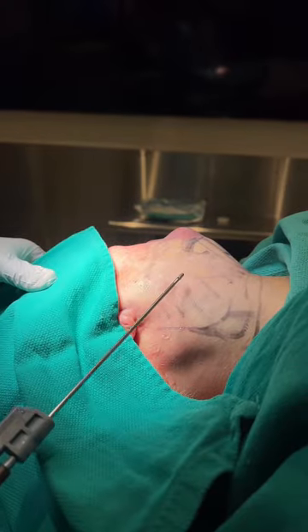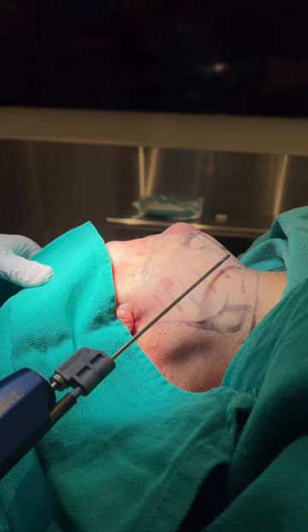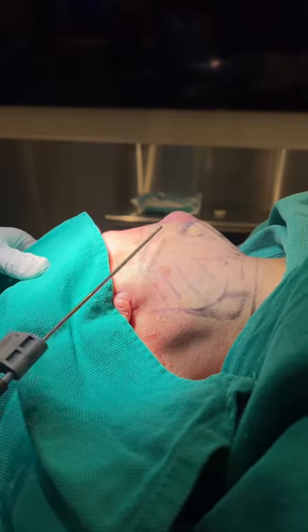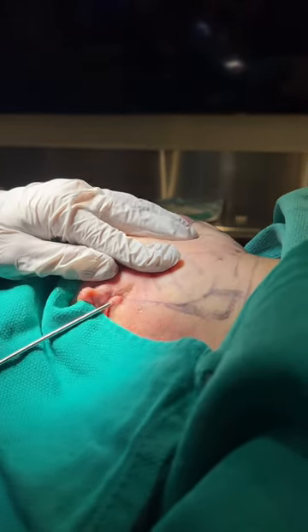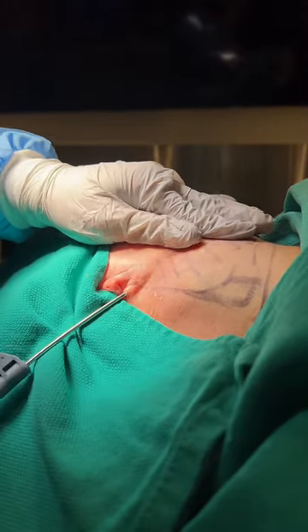We've added tumescent solution underneath the skin — everywhere it's white, which means she's numbed up and the epinephrine is working. We made a hole behind the ear as I mentioned, and we're starting to do the liposuction now.